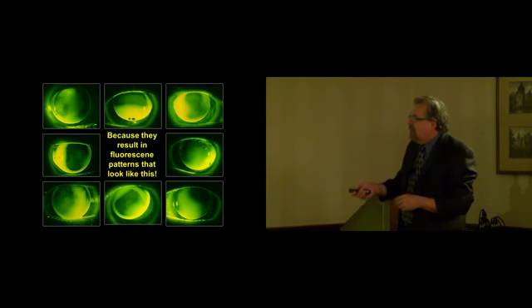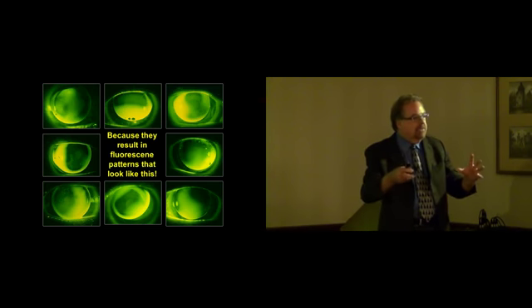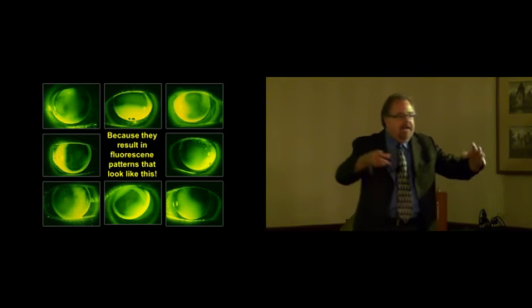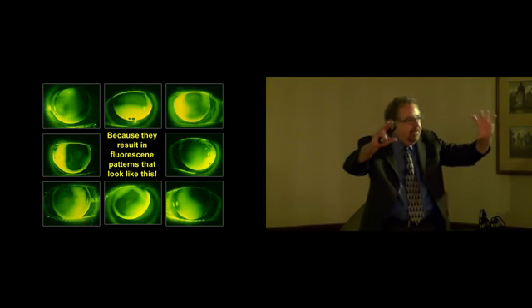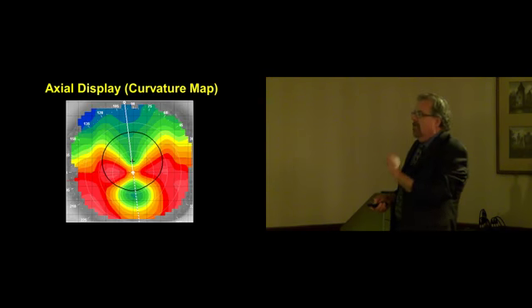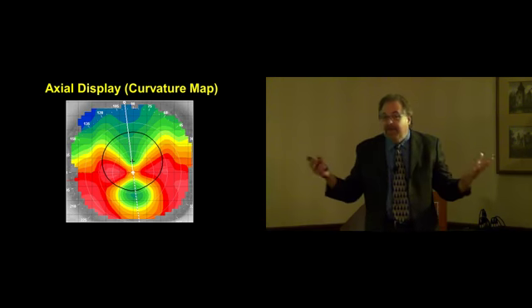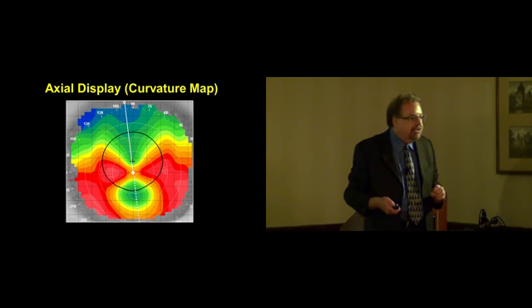When you have these kinds of asymmetry, it's almost impossible to get a rigid corneal contact lens to be stable on the eye. It doesn't have that luxury of landing on that symmetry in the cornea. So there are a lot of individuals with these kinds of topographies. Now let's take a look at this patient. Obvious diagnosis here would be pellucid marginal degeneration.